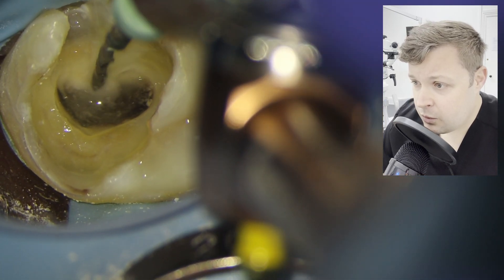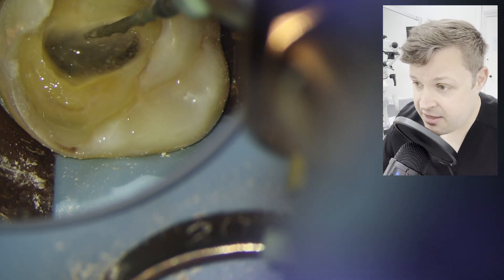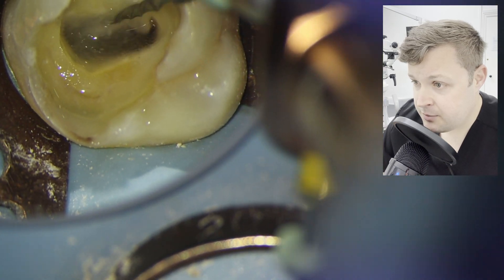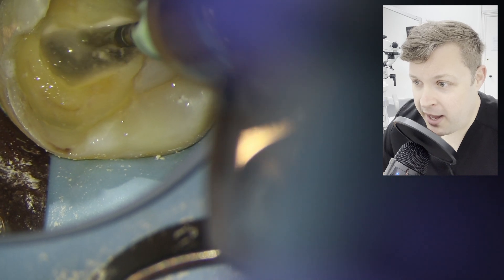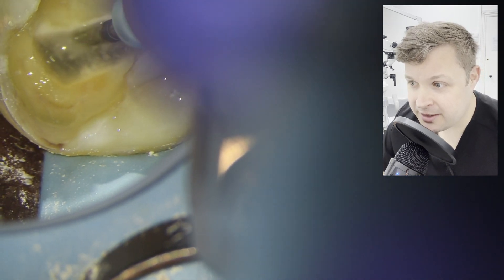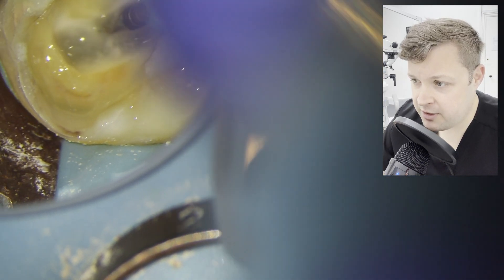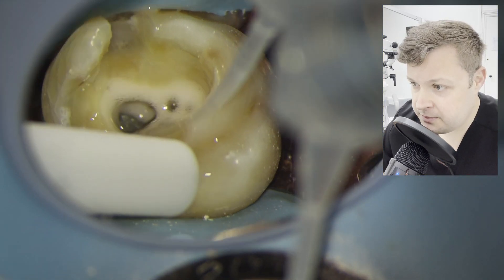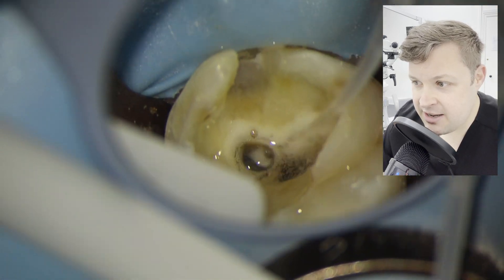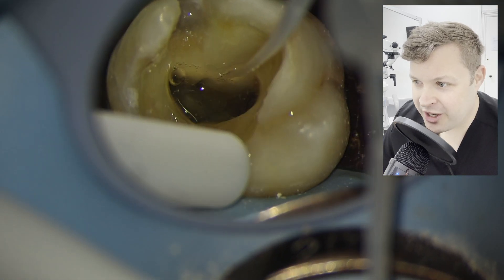Now using our master apical file — a HyFlex 20.05 — and just shaping nicely. I'm doing a few more pecks than I really should be, but I can feel the file going to length and I'm happy I'm not going to ledge or put too much stress on this file. It's gone really nicely to length. Lots of irrigation — it's nice to see the irrigation fizzing inside the pulp chamber because you know it's just working its magic.